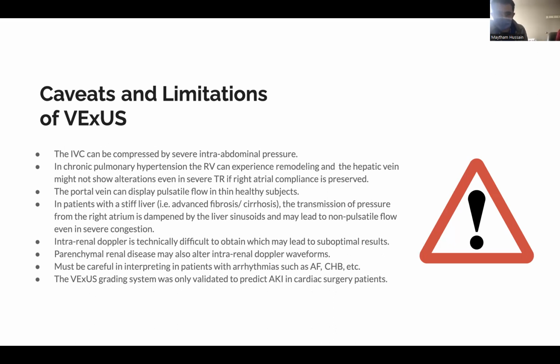So assessing and then reassessing after decongesting, and then looking at the different veins and different organs that we image can help bring together a more complete picture. The portal vein can display pulsatile flow, especially in thin, healthy subjects. So it doesn't necessarily always mean that that's abnormal.